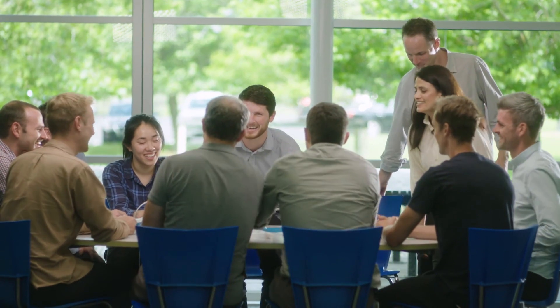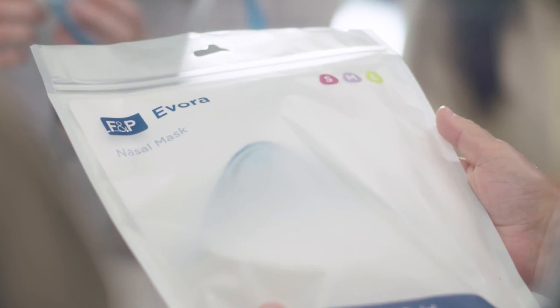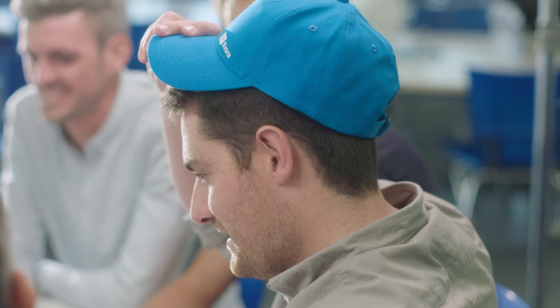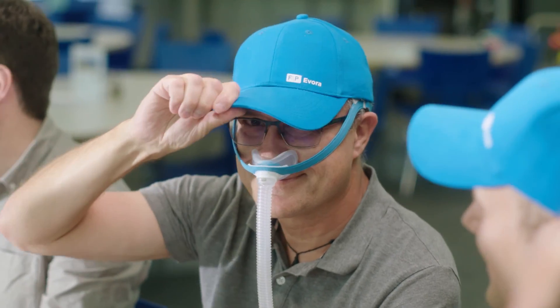I'm really excited about Evora. We're developing products that will really change lives, help it to be easier and more comfortable. To start from almost nothing to something you can tangibly feel in your hands and see the impact it has on a patient is a really inspiring and exciting process.